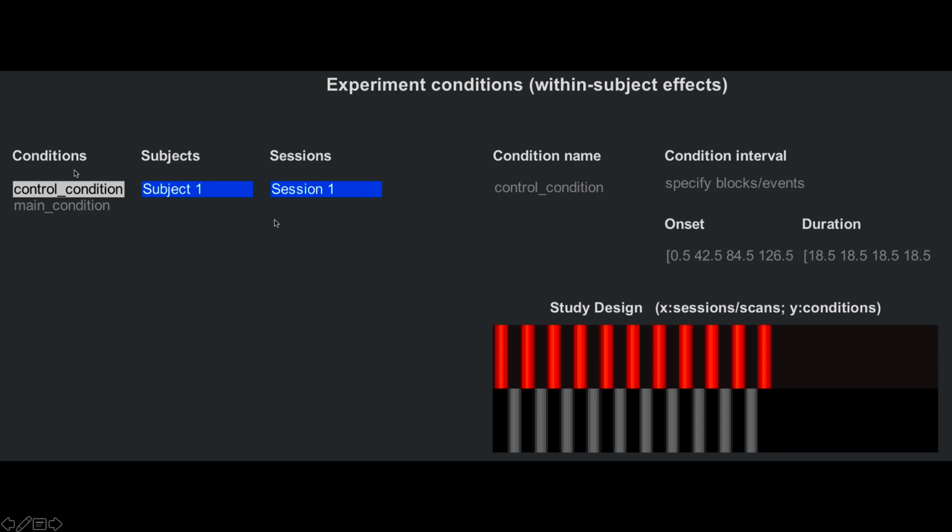So we're going to be moving on to these task-based analyses within the CONN toolbox, where you're modeling the effective task. I'll explain more about what these different bars mean when we do that practical.